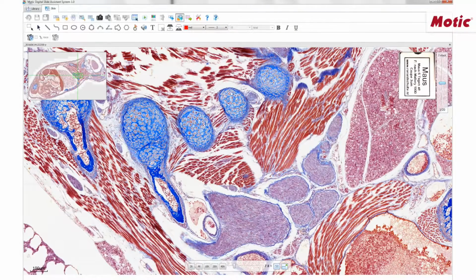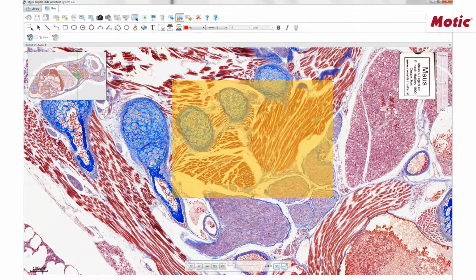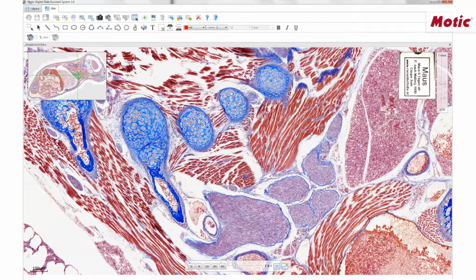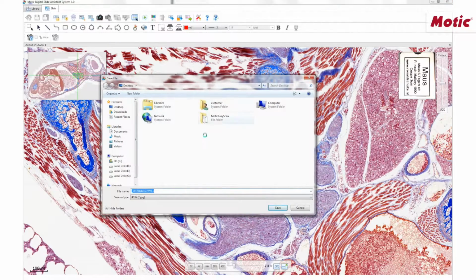Click on Export ROI and select an area of interest, which will be highlighted in orange. Double-click on this area to access the exportation window. Finally, for a fast and easy ROI export, you can just capture an image and a JPEG file will be generated.